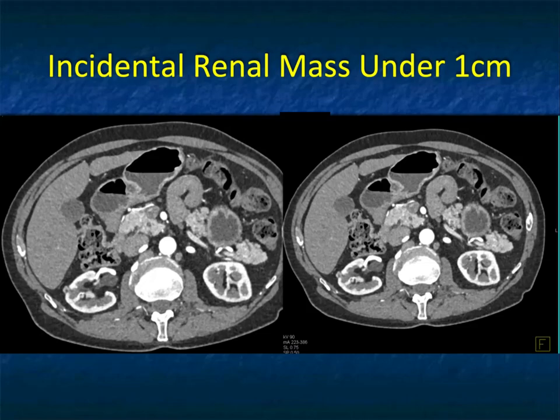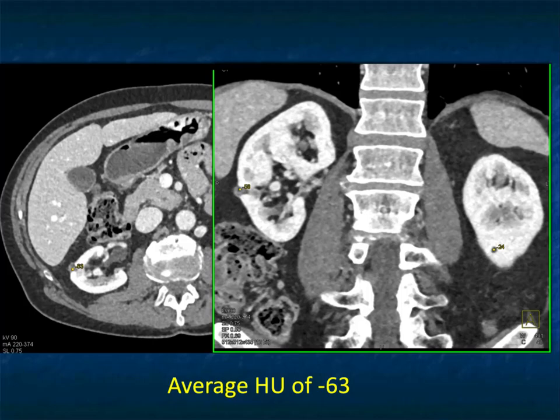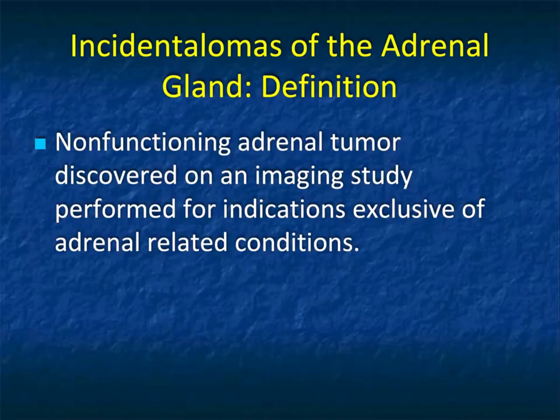It can be tricky — here's an incidental lesion in the right kidney. One rule people follow: if you have a small lesion under one centimeter, simply follow it. Do not be ablating or resecting lesions under a centimeter, because the likelihood of making a mistake and calling something a malignancy is too high. If you look very carefully, you can see a little dot — cursor reads minus 63 Hounsfield units. There's also a small angiomyelolipoma in the contralateral kidney, very difficult to see when you're in a rush.